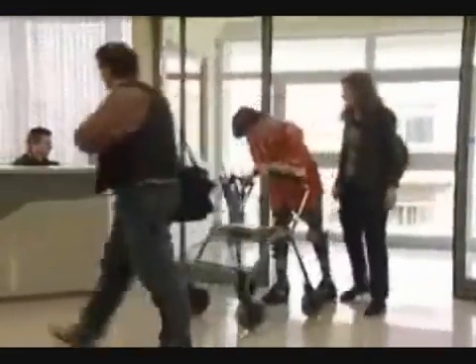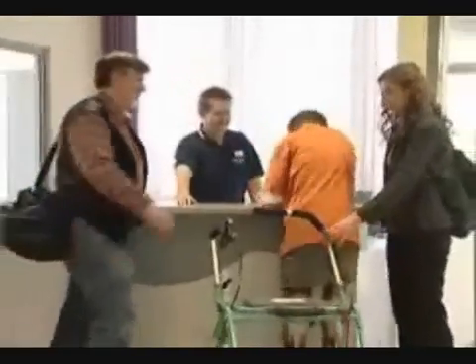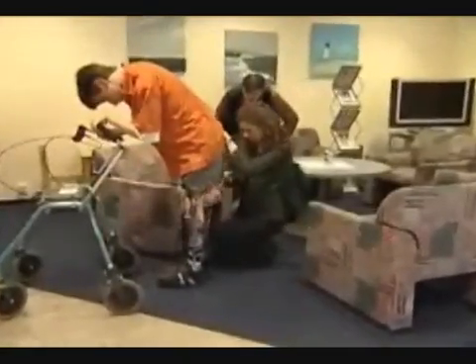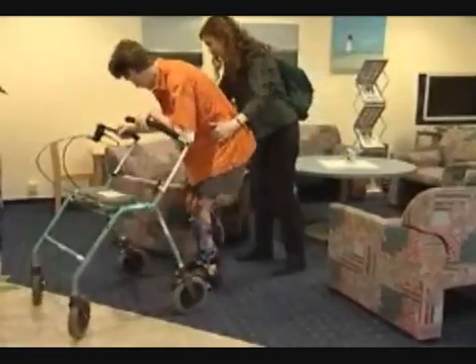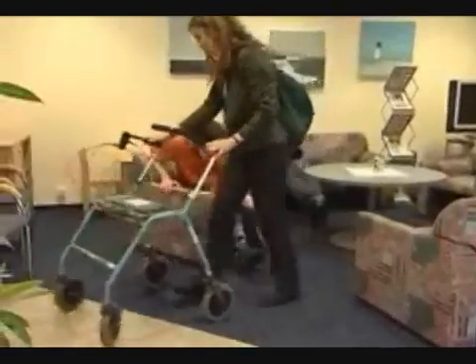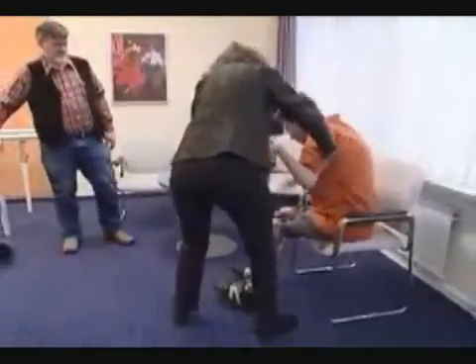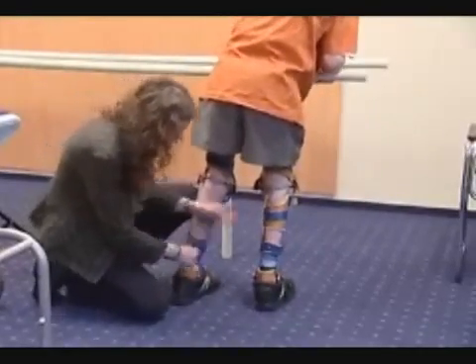Simeon's example shows how increased confidence in the joint combined with the electronic control feature can significantly enhance the mobility of people. With conventional bail-lock fitted orthoses worn bilaterally, Simeon is not able to stand or sit down on his own. He always had to rely on the help of friends or family to get him moving autonomously. Even indispensable everyday activities such as going to the bathroom on his own presented a challenge he could not cope with alone. He is not able to open or close his orthoses without help.